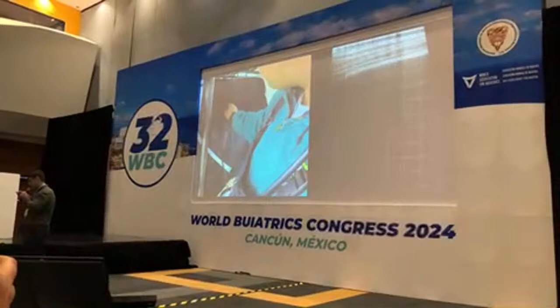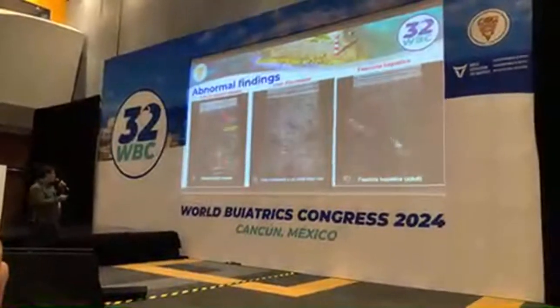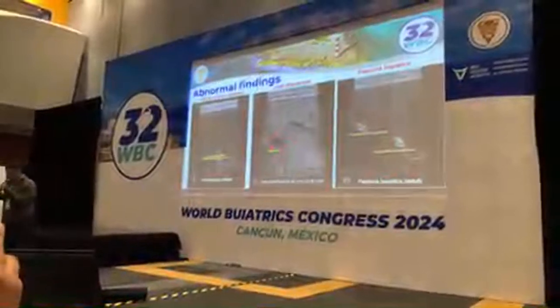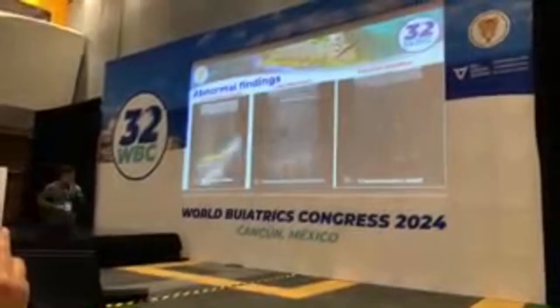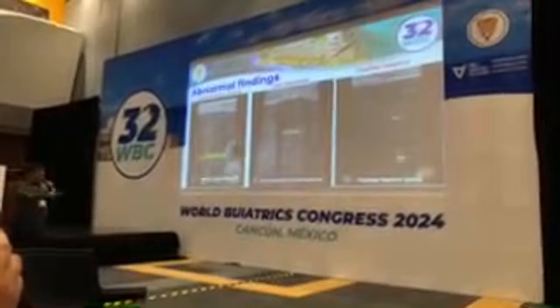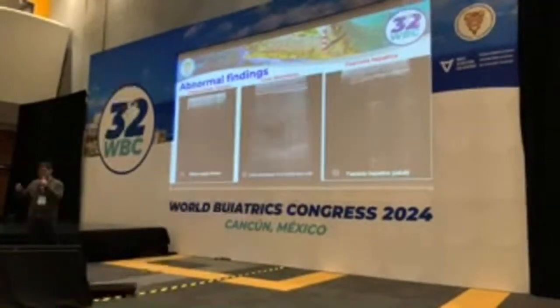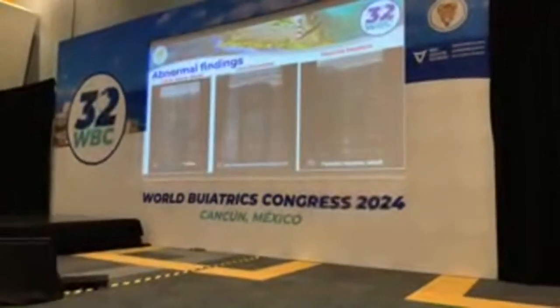The most important abnormal findings in that organ are the diffuse hepatic disease, which is very related with nutritional poisoning, that is very important in our place. Liver abscesses, there are a lot of sizes and amounts of liver abscesses. Fasciola hepatica, you will find sometimes; in this case, you find a cyst in the liver or the fluid floating right there.